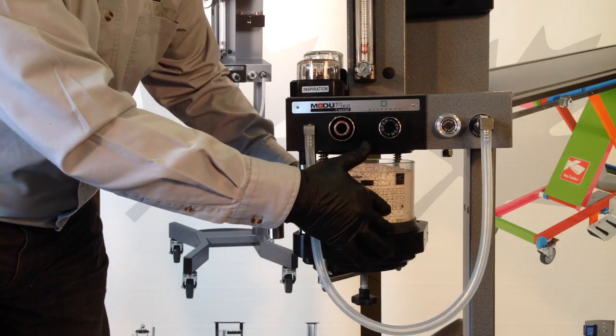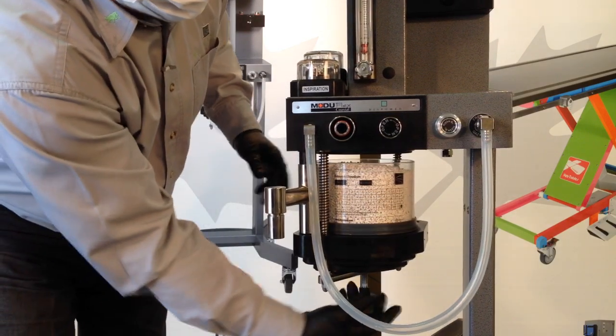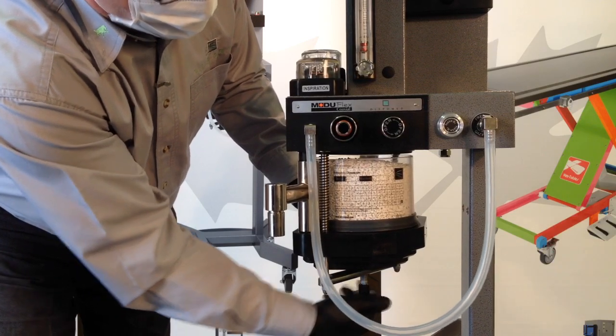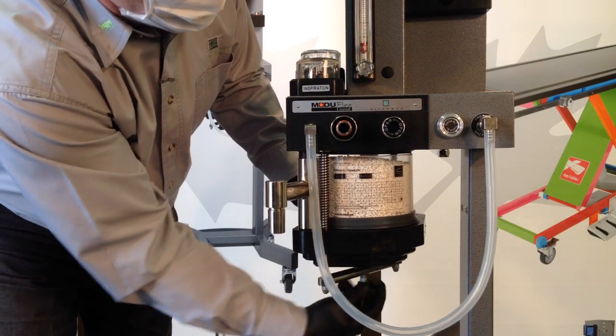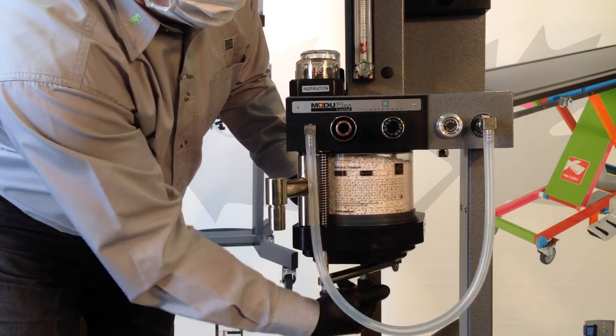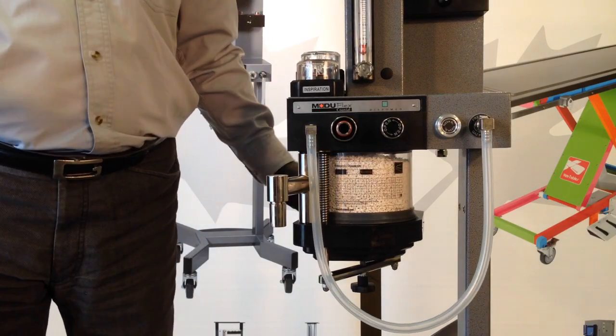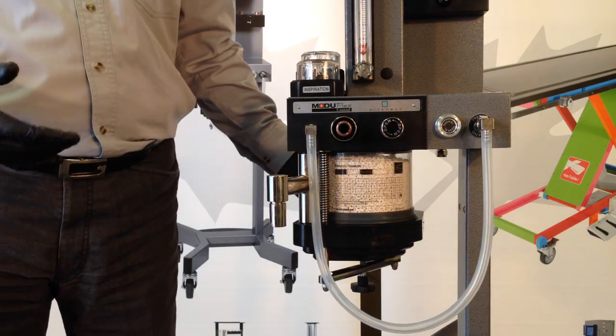Reposition the canister in place and tighten the sealant screw. Then perform a leak check on your machine before reusing it.